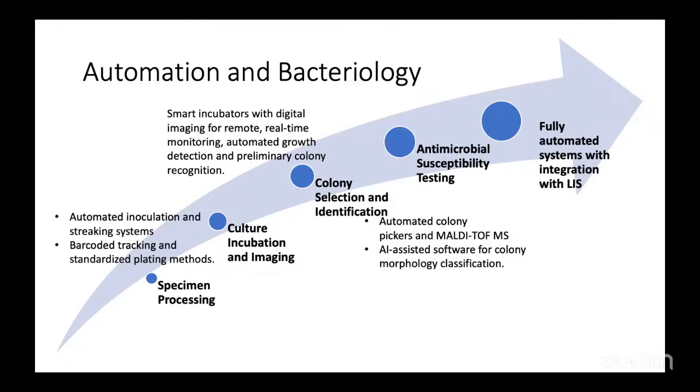Yes, you do. You need an automated inoculation and streaking system. You may need barcode tracking and standardized plating methods. Then when we talk of culture incubation and imaging, we just put the plates in the incubator, forget about them and read them the next day.